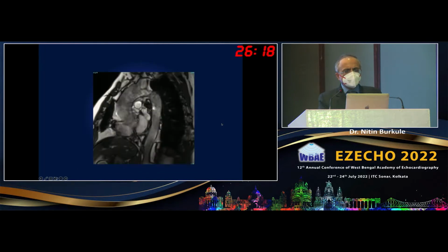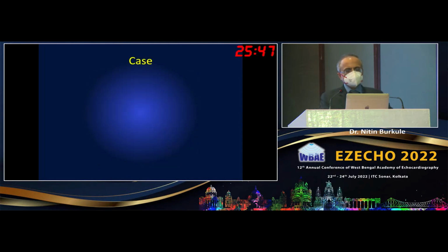And lastly, I can get the entire aorta, because as you know the bicuspid aortic valve is associated with aortopathy, so I can have a very good measurement of the aorta. And you can also see the jet, how it is hitting the anterior wall, and you know how difficult it would be to align the Doppler jets in these patients. But anyway, I get the information of the aorta. So there are 4-5 important pieces of information we could add to the echo information, which has got a direct significance in this patient's outcome. Okay, so this is how the things can help.